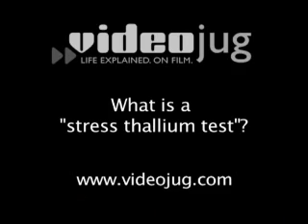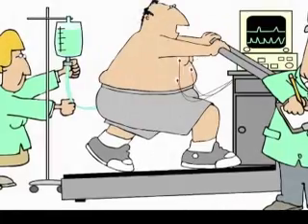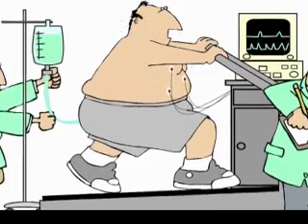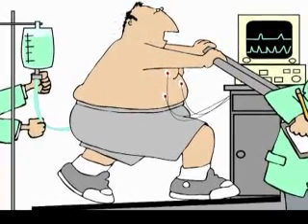What is a stress thallium test? People usually call it a stress thallium test because previously thallium was one of the most common tracers used. But basically, it refers to the procedure of doing a cardiac perfusion imaging study. And in that, we normally have a patient imaged after or during a type of cardiac stress. Most commonly, it's when a patient runs on a treadmill or on a bicycle ergometer. But it can also be done pharmacologically, not necessarily through some sort of a dynamic exercise. That's the stress portion of it.